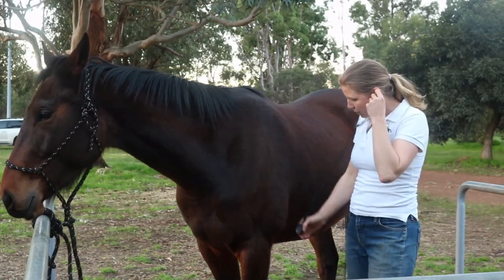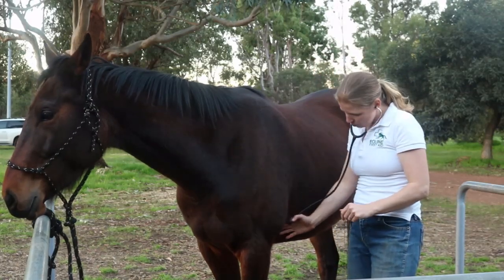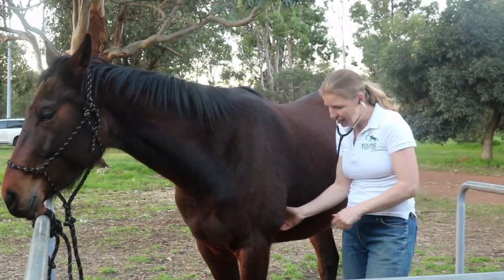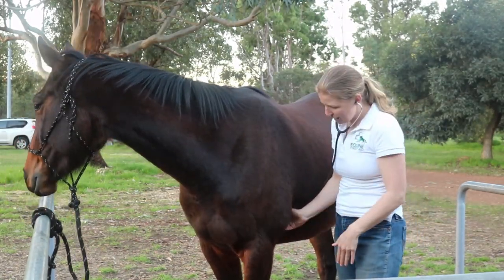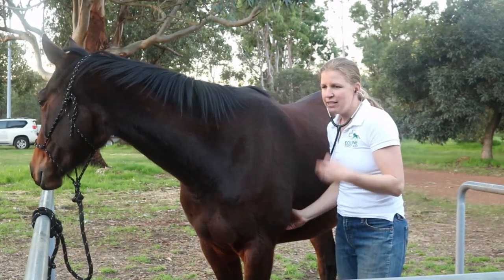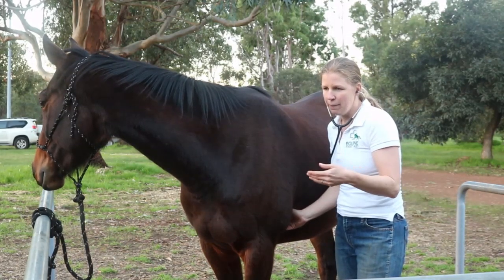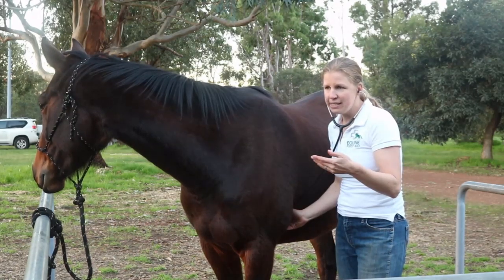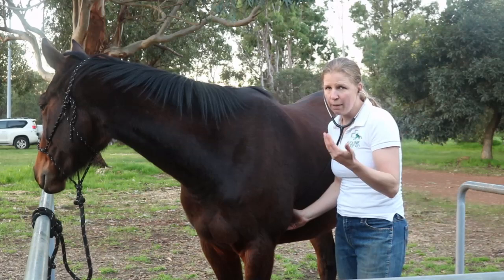I go to the left side, right behind the front leg where the point of the elbow meets the ribcage, in this nice little groove here. His leg is a little bit forward, so that makes it even easier to find, and I can hear a nice loud lub-dub, lub-dub.